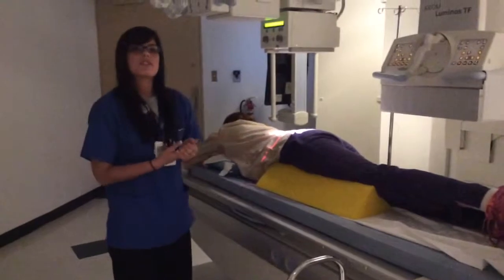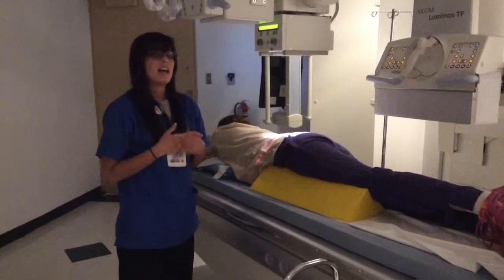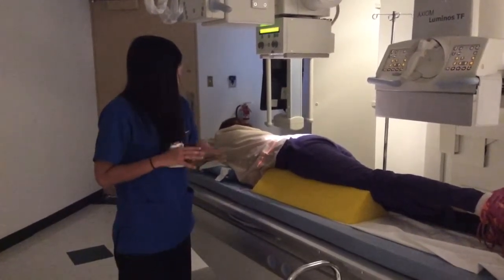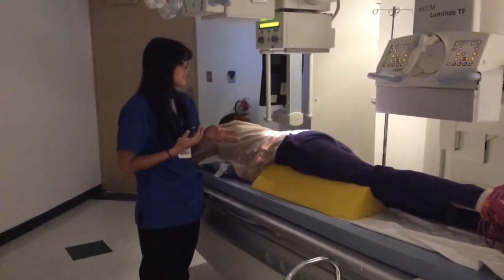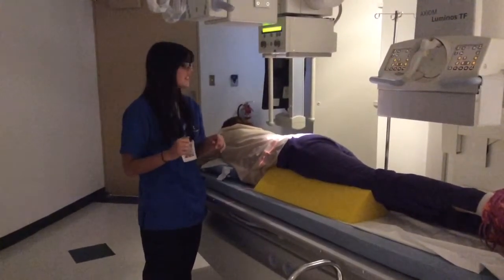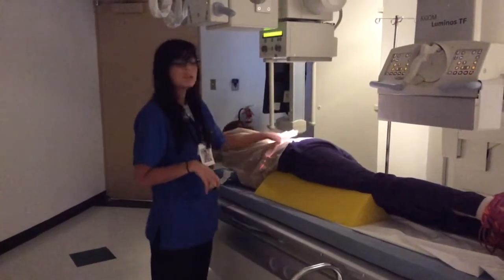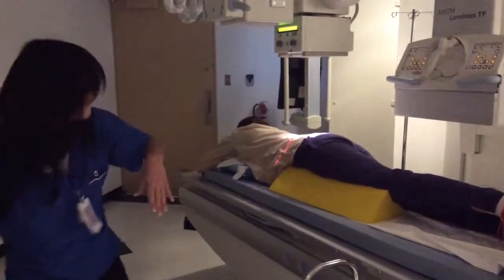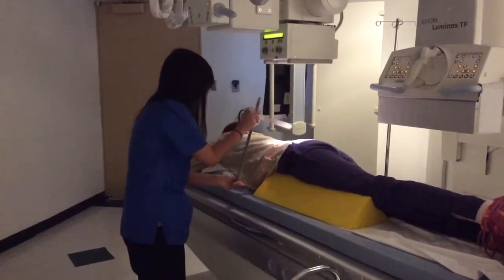This projection helps us visualize the ileocecal valve a little bit better, which will verify that barium has entered the large intestines. If you can't get a good view of the valve with this position, fluoro is another way that you can visualize it. They would normally use a compression paddle to help separate the bowels, to spread them out, to see the valve a little bit more. Now that I have my patient positioned, I'm going to go ahead and measure again.